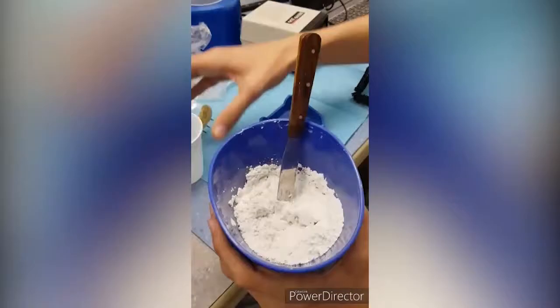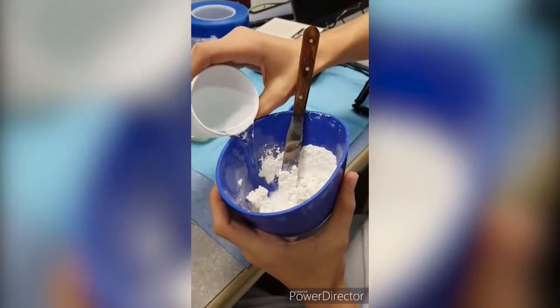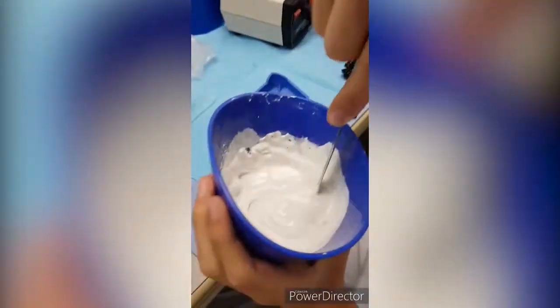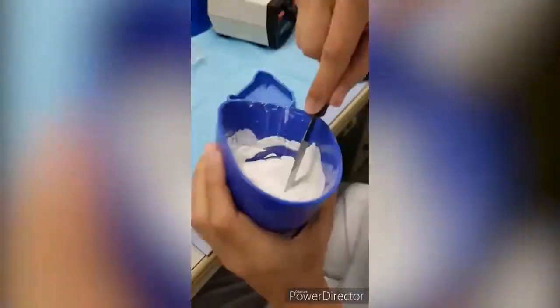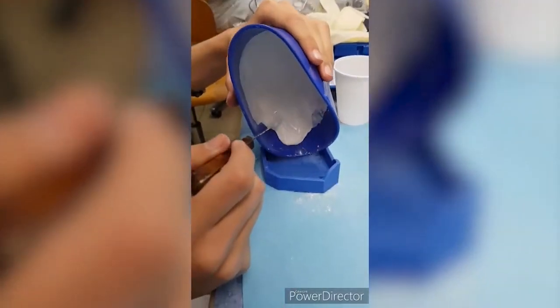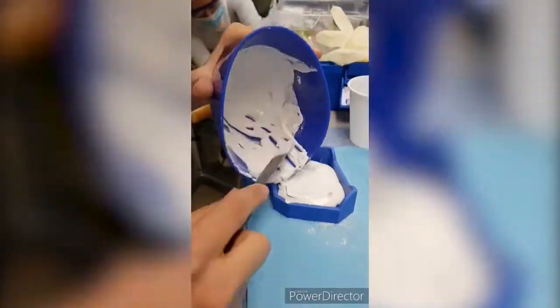Powder and water should be mixed to obtain adequate consistency, which is cream-like. After pouring the gypsum, shake the base former in order to eliminate air bubbles.